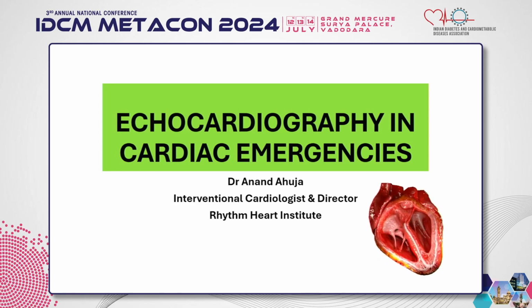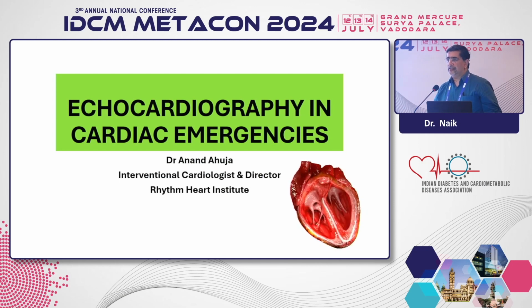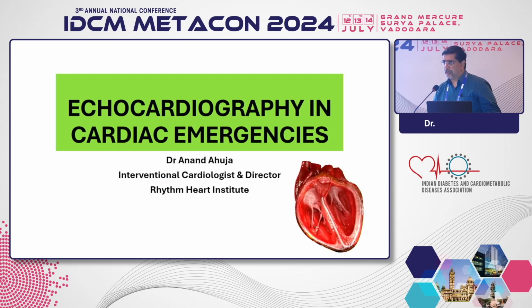Thank you so much for this opportunity to speak about the use of echocardiography in cardiac emergencies. Why do we need echocardiography? Because echocardiography looks at the cardiac structure and function. Most of the cardiac emergencies, when they present in the ER or in the ICU, or arise in the OT or in the cath lab, usually the clinical signs should be sufficient.